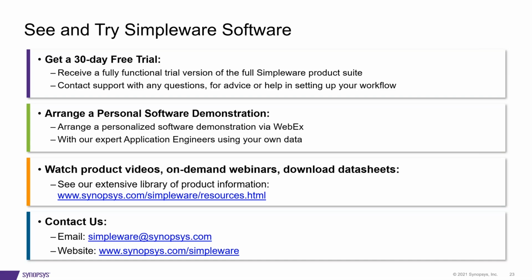No, I think you covered it really well. In terms of the support side, we're more than happy to help you in that area and provide some examples and help you build your scripts, or as Karim mentioned, into the more consultancy side and custom modeler, where they're customized to you.